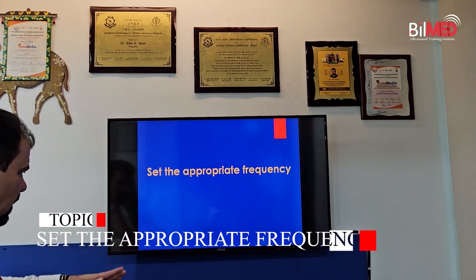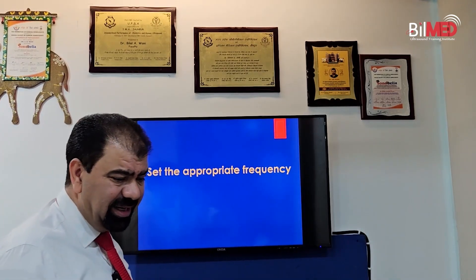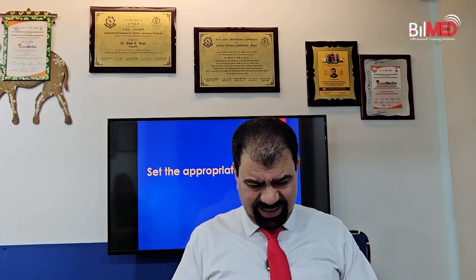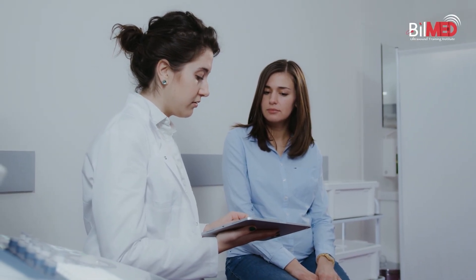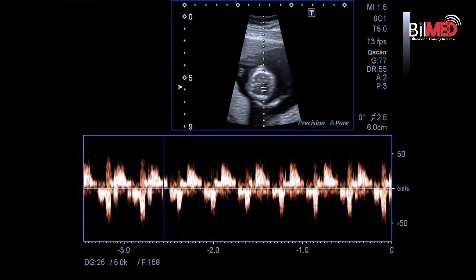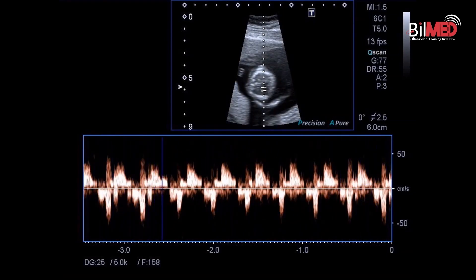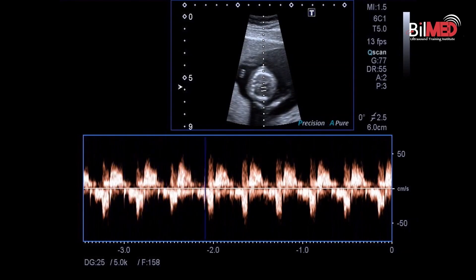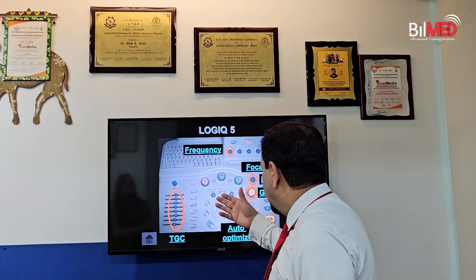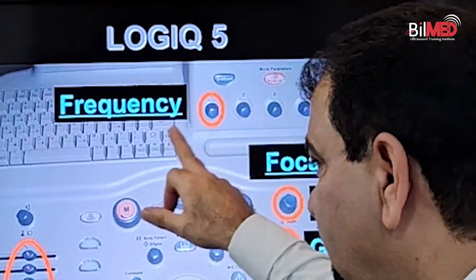Second, very important, is the frequency. You have to set an appropriate frequency. If you are scanning an obese patient, you need penetration, and penetration is possible only when frequency is dropped. So drop the frequency for obese patients. If you are scanning a thin patient, you can increase the frequency, and by increasing the frequency, your resolution also increases. This is the frequency knob on this machine — set your frequency as per your requirements.